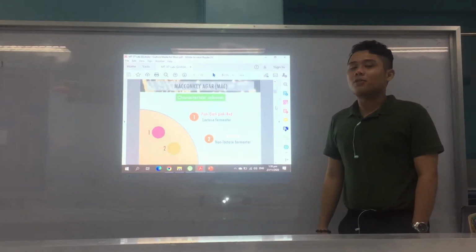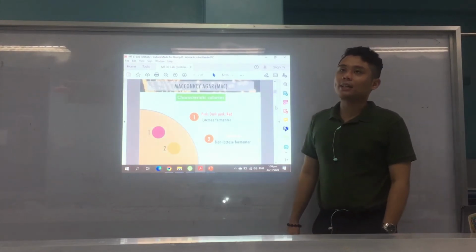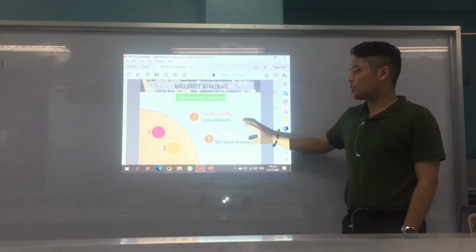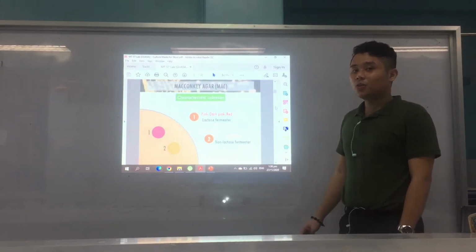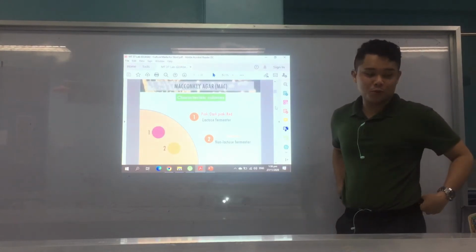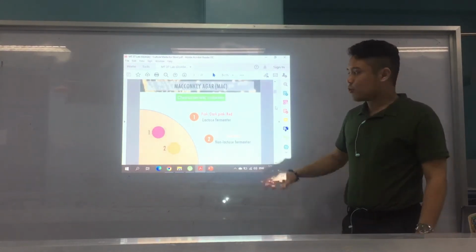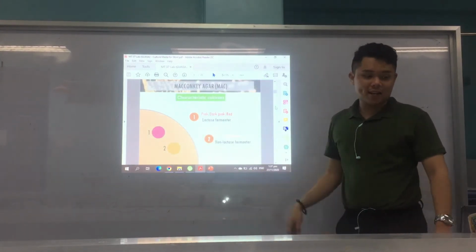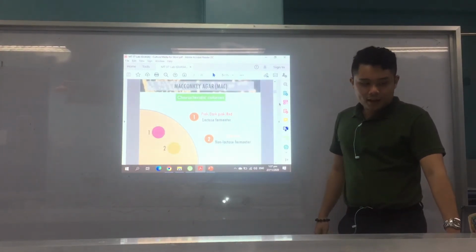Now, usually if you are really looking for pathogens, okay, katulad sa mga non-enterics or mga enteric pathogens, usually ang pinaka-significant gyud is the colorless, okay, non-lactose fermenter, if gikan sa stool. Okay, we'll discuss that later sa atong stool culture na lecture. Okay, so but again, these are the different characteristic colonies na dapat lantawon for MacConkey agar. Okay, so that's the first culture medium.